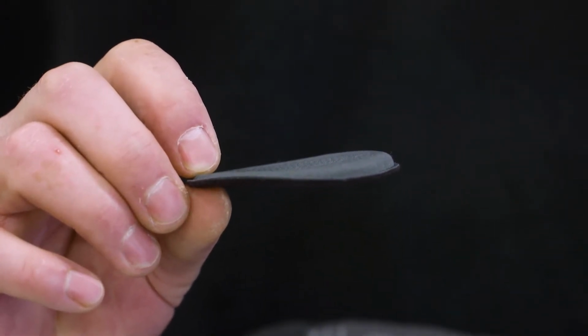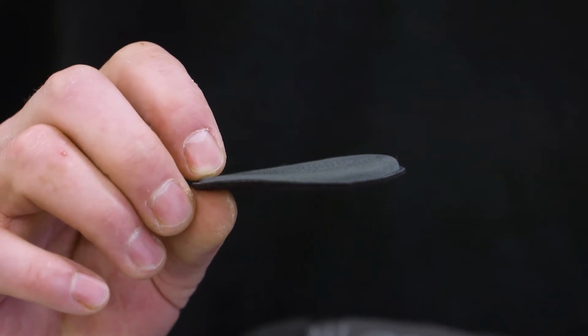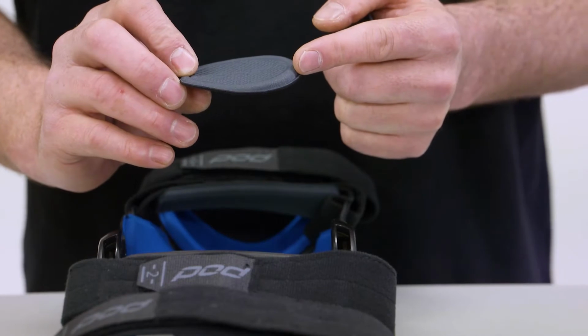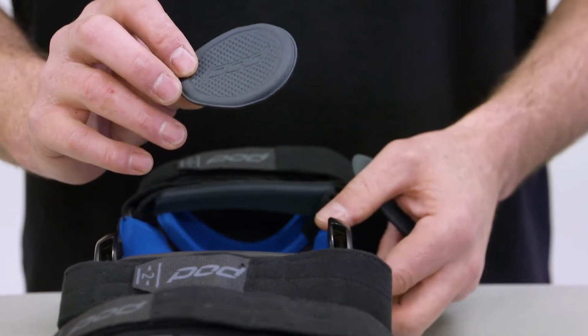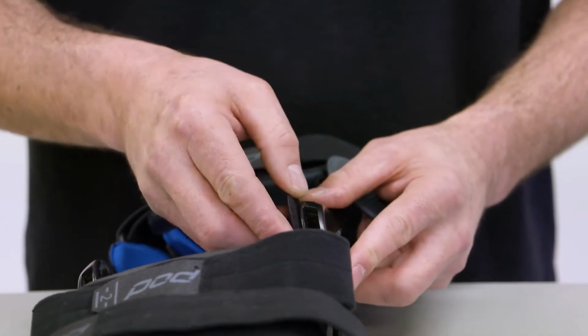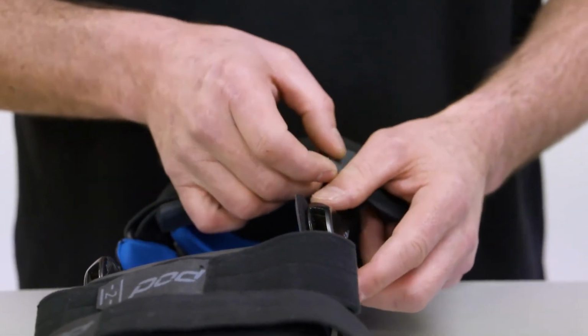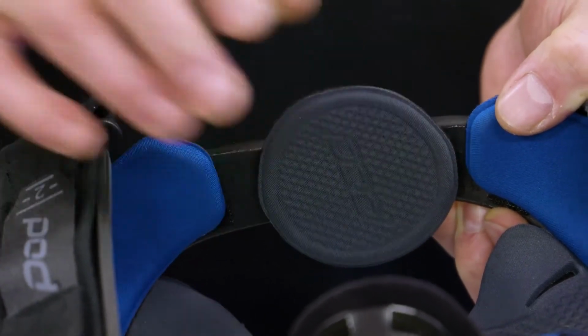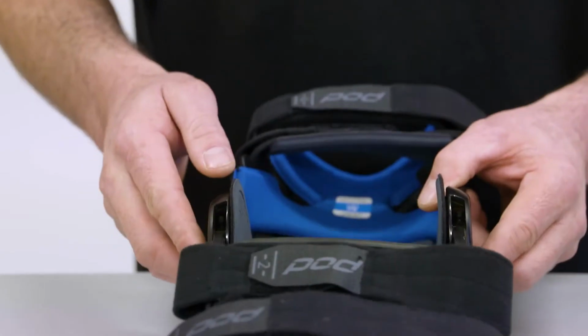So each knee pad or hinge pad has a thicker part and it tapers off to a thinner part at the back. So that thicker part will be at the front of the brace, which is on the patella side of the brace. So put the thicker part toward the patella and that will be thinner, tapering off to the back side of the brace, which will be at the back of your knee. So ultimately you will have more support toward the front of your knee.